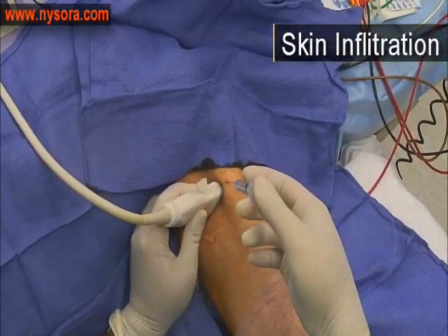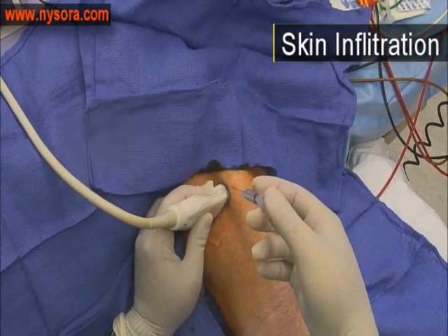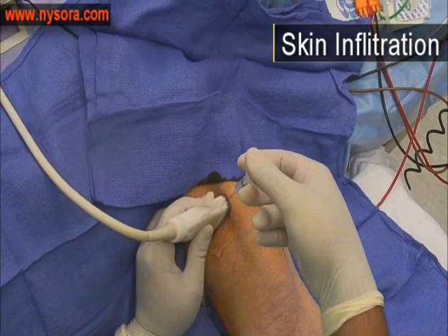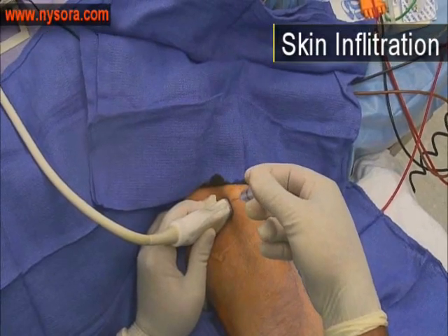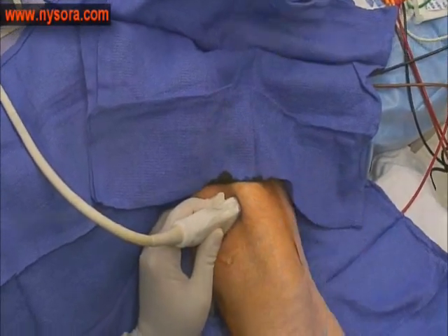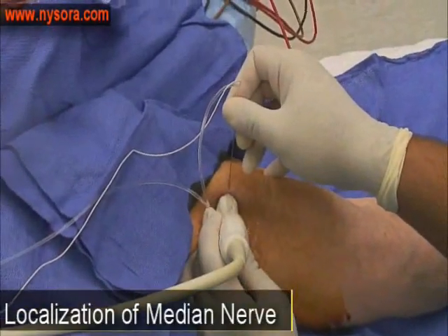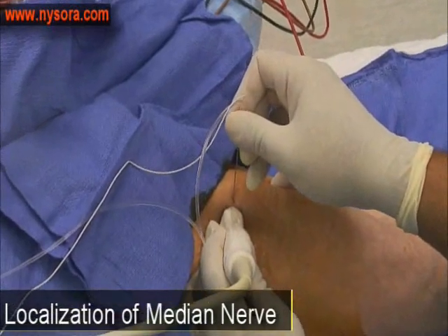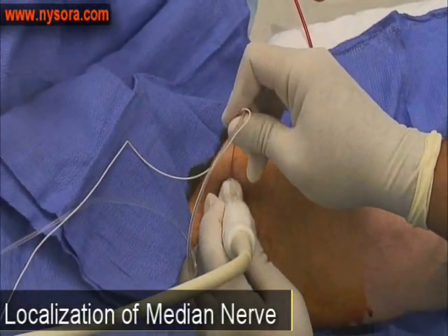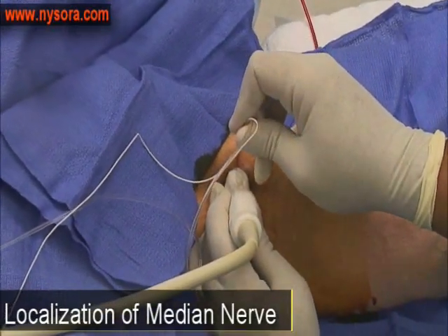The skin is infiltrated with local anesthetic. The stimulating needle is then placed in line with the ultrasound transducer.